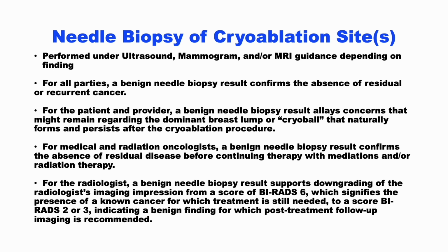Routine needle biopsy of the cryoablation site plays several key roles in the follow-up and management of the cryoablation patient, and may be performed under ultrasound, mammogram, or MRI guidance depending upon the characteristics of the cancer. For all patients, a benign needle biopsy will confirm the absence of residual or recurrent disease at the cryoablation site. For the patient and provider, a benign needle biopsy result allays concerns about the dominant breast lump or cryoball that naturally forms after the cryoablation procedure and persists for years.